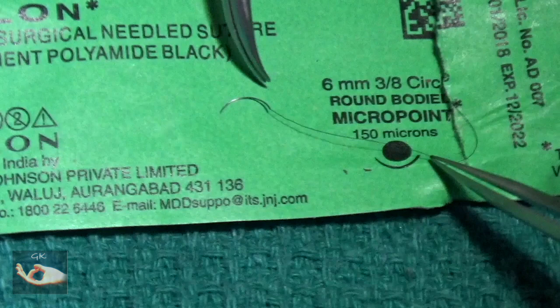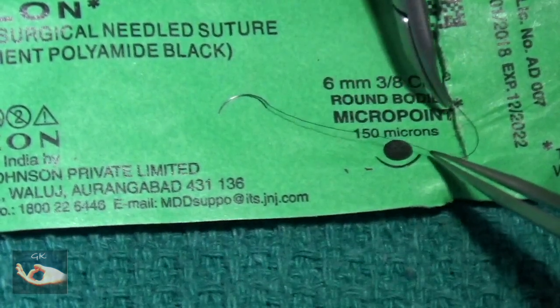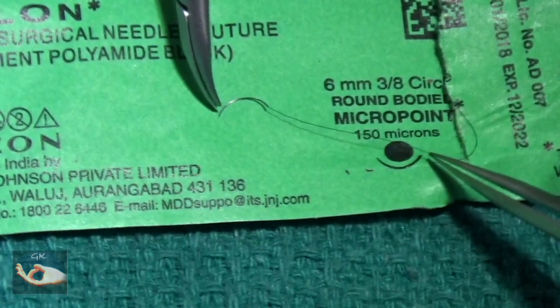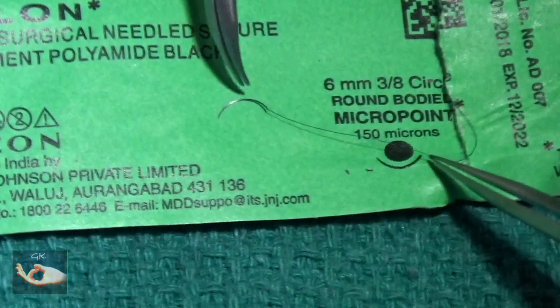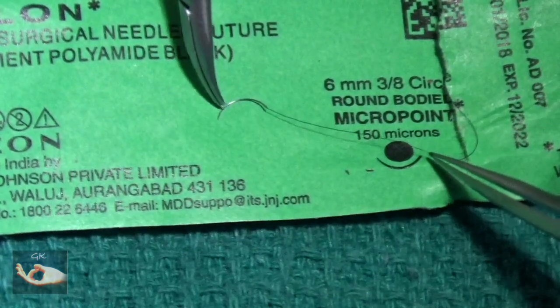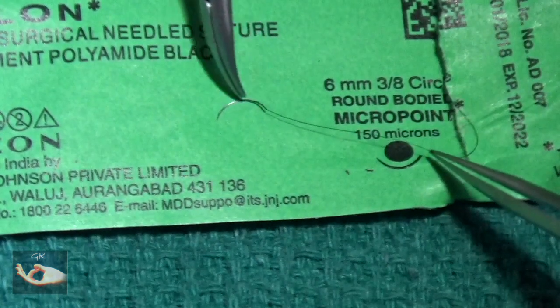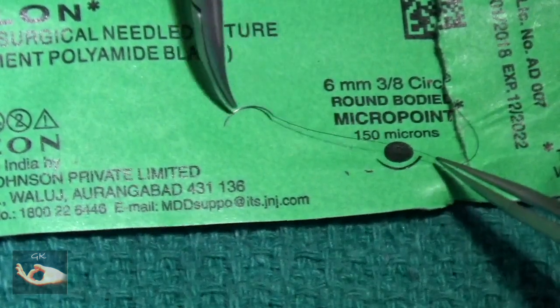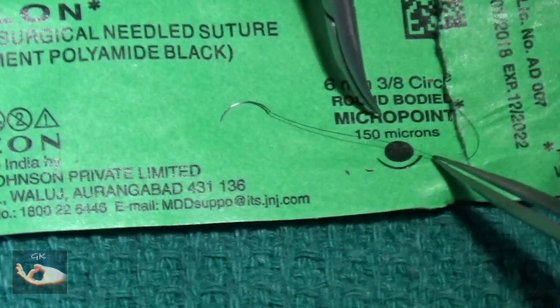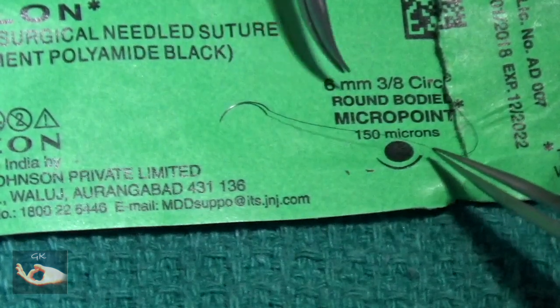The micropoint refers to the tip of the needle. From a rounded shape, it becomes a tip immediately. That is the micropoint needle, as opposed to the spatulated needle where it is flatter — that will not be ideal for a microvascular repair, as the hole made by the needle will be larger than the size of the suture material. The 150 microns refers to the thickness of the needle. Nowadays, you have much thinner needles to the tune of 75 to 100 microns too.